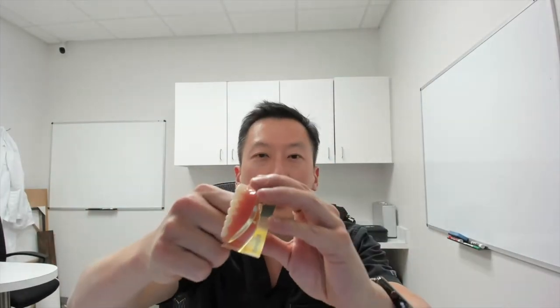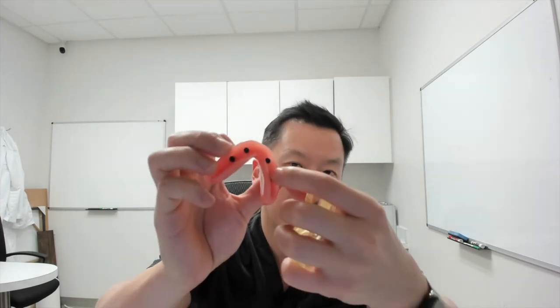Here's the thing. If you're taking it in and out over and over again over the period of months, those nylon inserts start to wear. Over time, whether it's 3 months, 6 months, or 9 months, everybody's different depending on how often they're taking it out, these inserts need to be replaced eventually. It's a really easy appointment, and it's not very expensive at all. You go in and see your dentist, and they'll snap it out real quick.